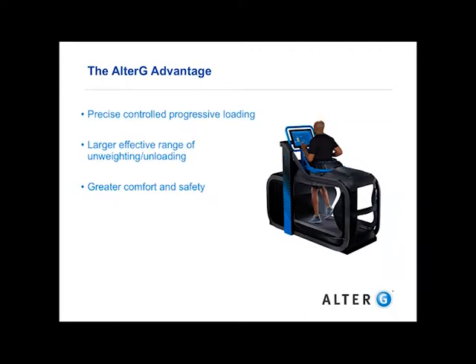We have neuro patients that use it for 45 minutes to an hour to practice standing, weight shifting, gait training. So you can imagine the amount of repetition, the amount of mass practice that they can get to encourage motor learning. And again, because it's comfortable, because we're not introducing resistance like you would get in water if you're doing aqua jogging or underwater running, you get normal gait and running mechanics.